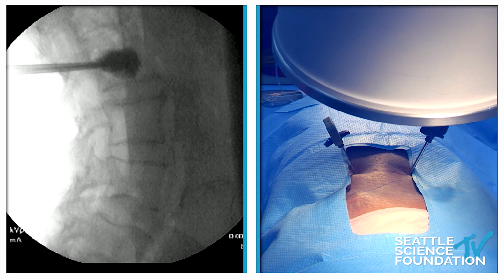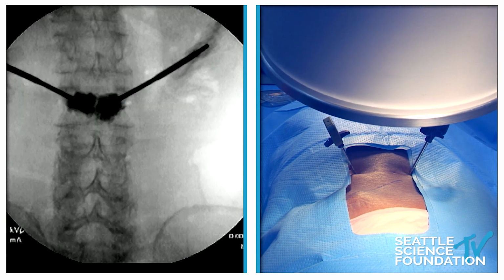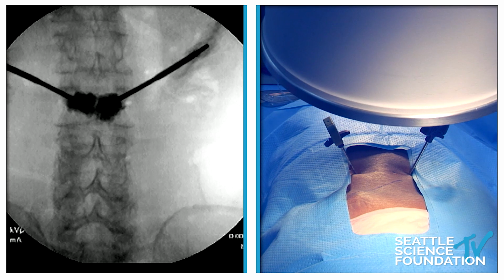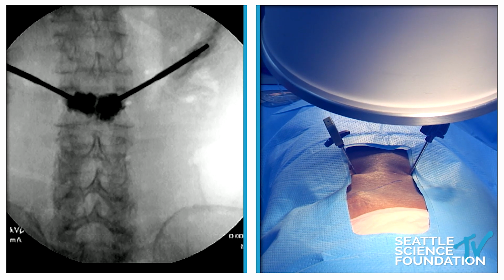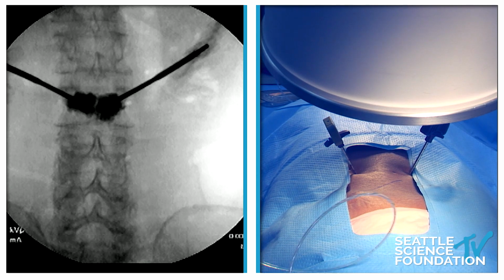Since the curing of cement is exothermic, if you provide heat, those are terrific AP lateral pictures, Doug. Great job. Thanks. If you provide heat, you can accelerate the cement hardening, and that diminishes the likelihood that the cement will extravasate out because it's thicker putty. If it's very thin, as in liquid, it can readily extravasate. And you'll see it showing up in veins, you'll see it showing up outside the vertebral body, you'll see it showing up in the disc space. If it's thicker, it has a less likelihood of doing that.